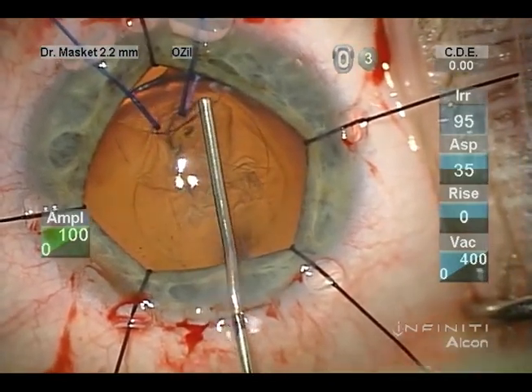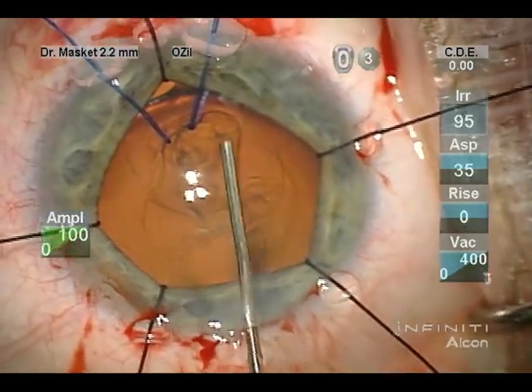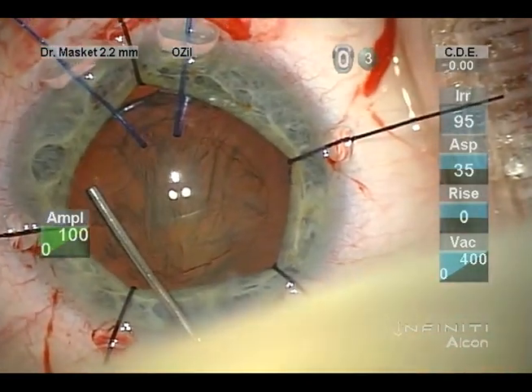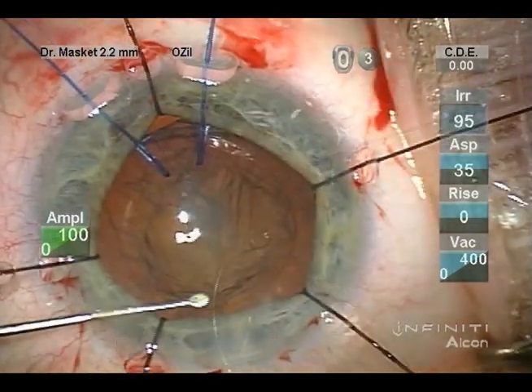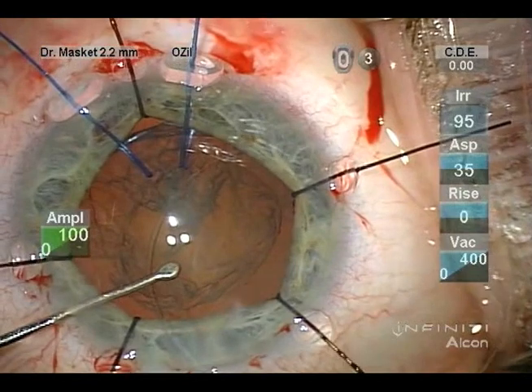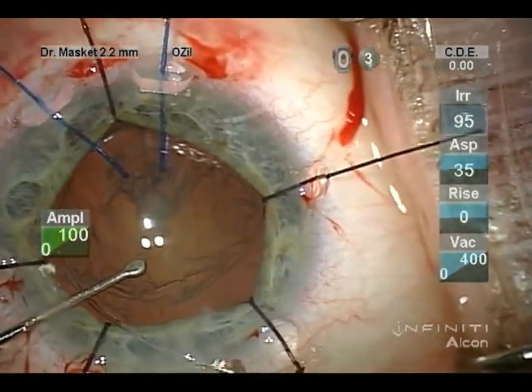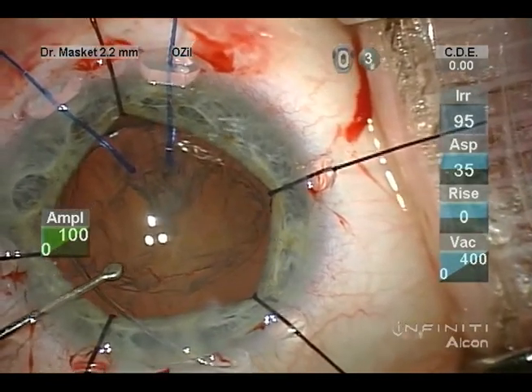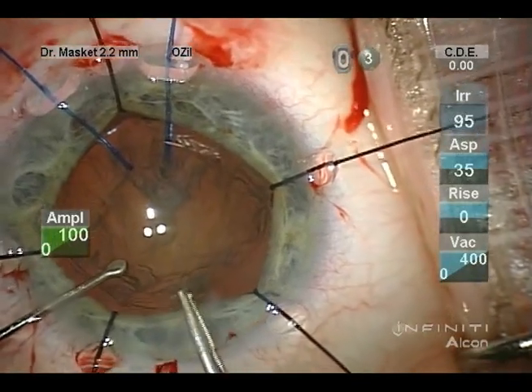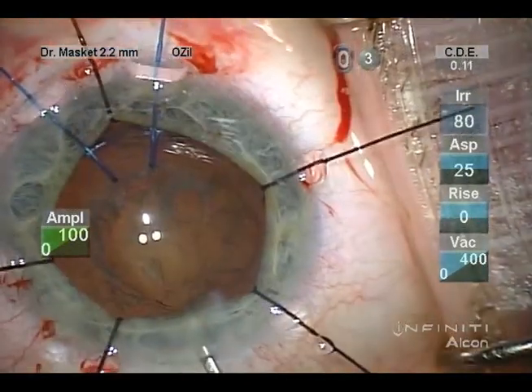A dispersive OVD is placed over the area of exposed hyaloid face in order to maintain its integrity. Hydro and visco dissection then allows the placement of a capsule tension ring in the early phase of surgery. This approach was done in an attempt to further place the lens in a central position and to put the posterior capsule on stretch, though I generally prefer to empty the capsule bag first.